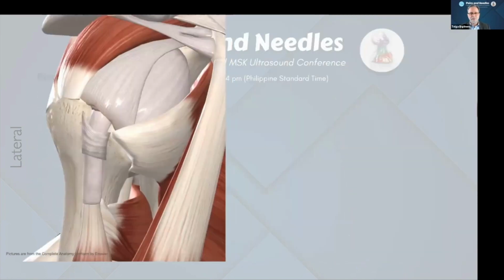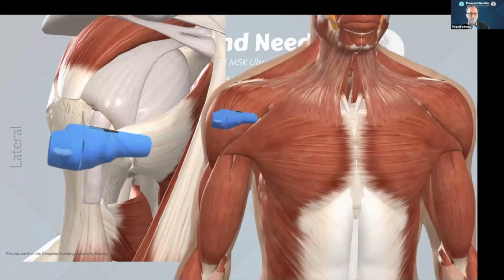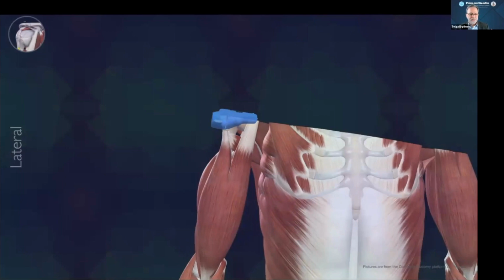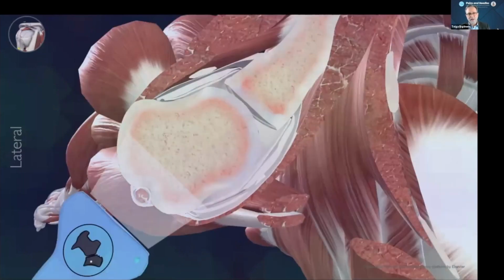When you put your transducer over the anterior window of the shoulder like this, the ultrasound beam cuts the tissue like a knife. You can see the most superficial muscle is the deltoid muscle, which is under the skin. You can also clearly see the greater tuberosity, lesser tuberosity, and long head of the biceps.